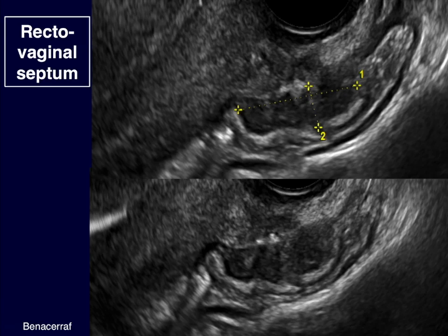So there's really a lot of evidence that if you look carefully at the area right behind the posterior fornix, right at the outer edge of the posterior lip of the cervix, where the rectosigmoid should lie nicely along the back, you can see these nodularities that are so characteristic. And then, of course, these patients usually have a lot of pain, and you can actually discover the pain that they have as you probe very gently in that area, and they will react when you actually come to the area of endometriosis, because they will tell you that that's where it hurts.